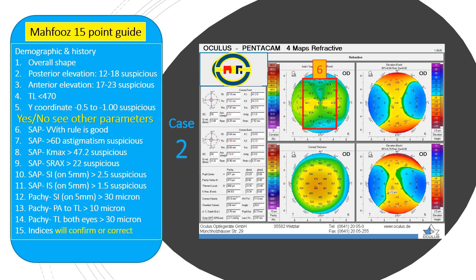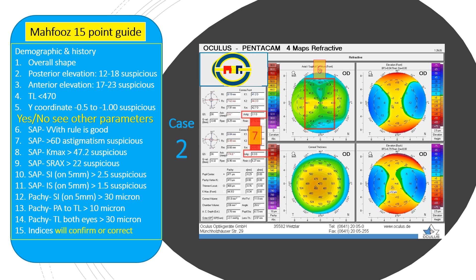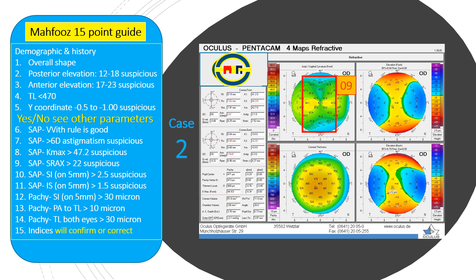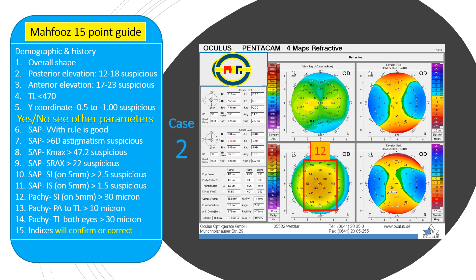Number six: the bow tie is horizontal, not vertical. With-the-rule astigmatism or vertical bow tie was good, so a horizontal bow tie is not good. Number seven: astigmatism is less than six diopters — good. Number eight: K max is less than 47.2 — good. Number nine: srax is less than 22 — good. Number ten: superior-inferior difference is less than 2.5. Number eleven: inferior-superior difference is less than 1.5. Number twelve: superior-inferior pachymetry difference is slightly more than 30 microns — it is actually 32 microns.